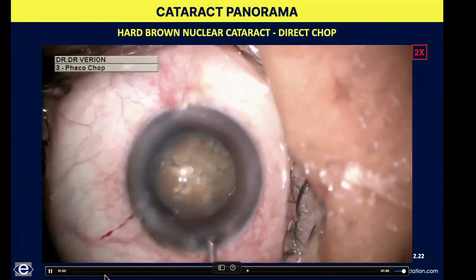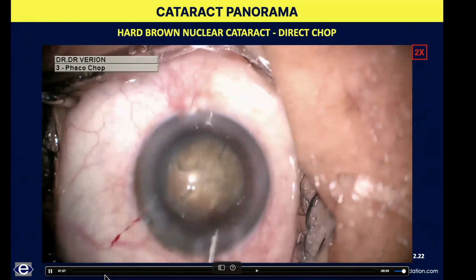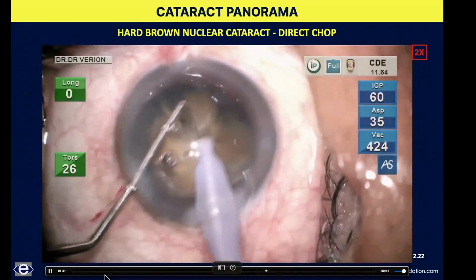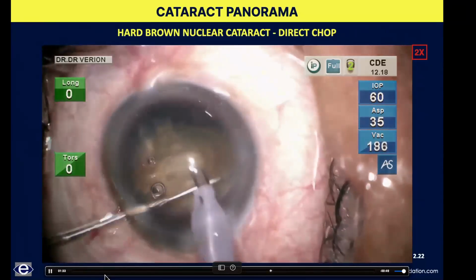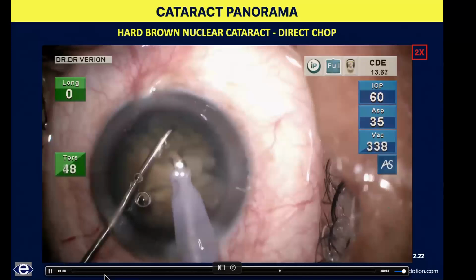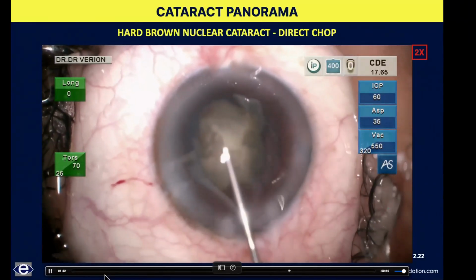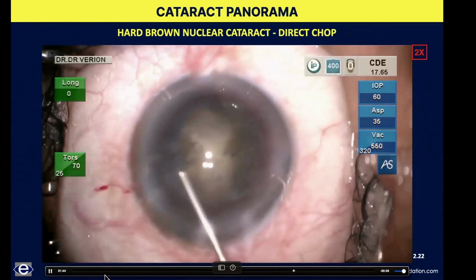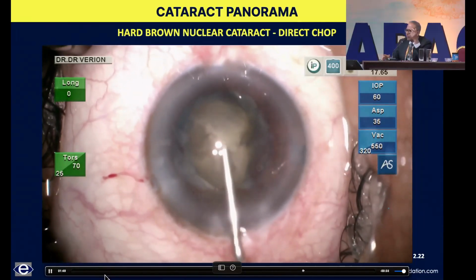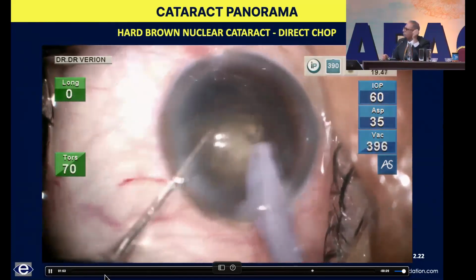So these are the different things which I'm doing, because cataract surgery has become refractive surgery. But the most important thing is that in these hard cataracts, they want the wow factor also. And the challenge is to give the wow factor in these brunescent cataracts. So we have to use deeper plane emulsification, as Vasavada has taught, viscodispersive again and again, and make very small nuclear fragments.